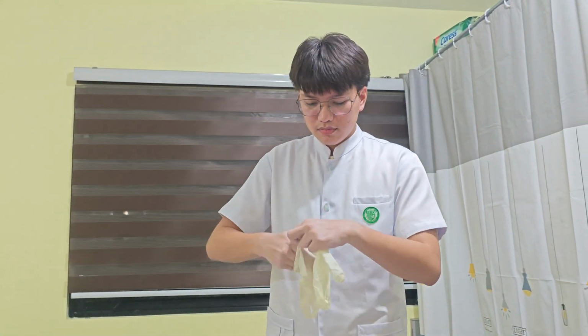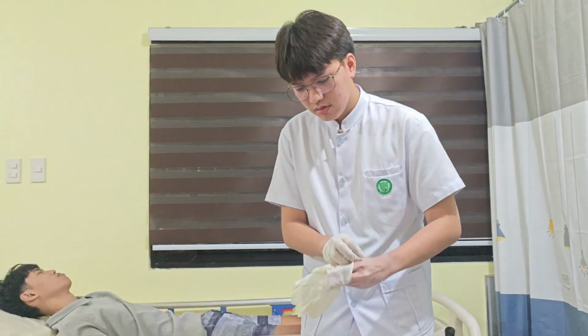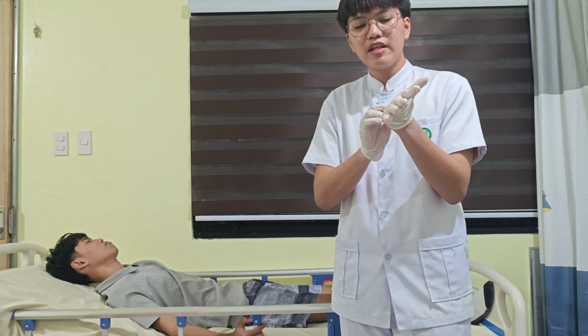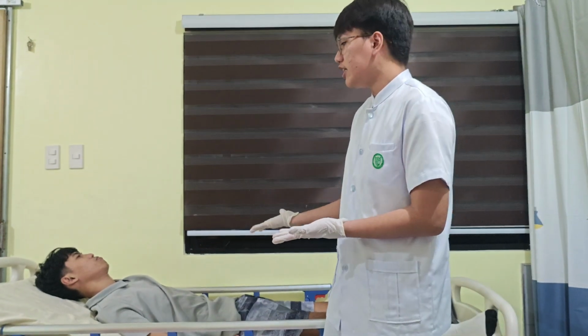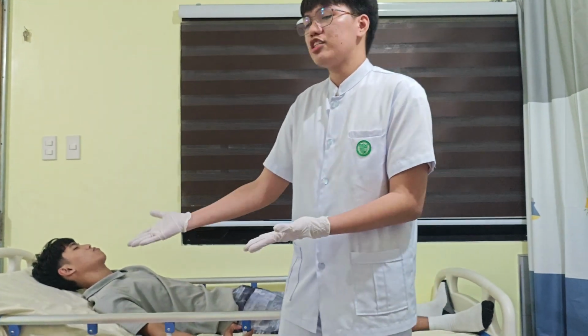Let me just get my gloves. After performing hand hygiene and putting on gloves to prevent the spread of microorganisms, I'm going to identify the patient. Assuming that I've already identified and explained the procedure to the patient, we do this to verify the patient is receiving the right treatment and to alleviate the patient's anxiety. After that, if necessary, I'm going to remove all the equipment on the side of the bed to make way for the chair.